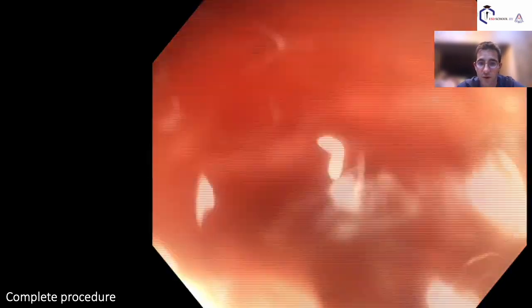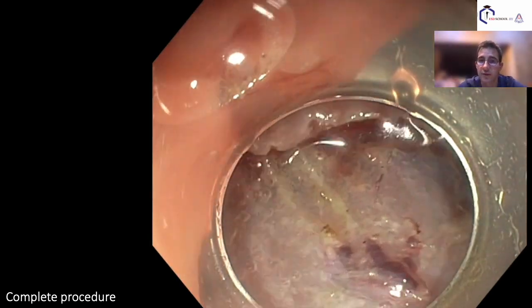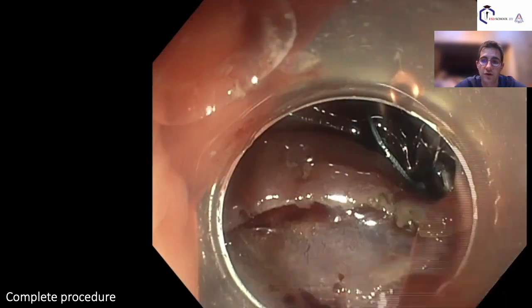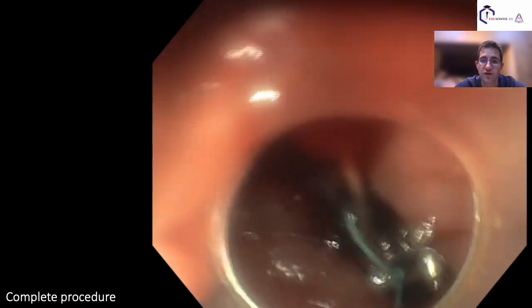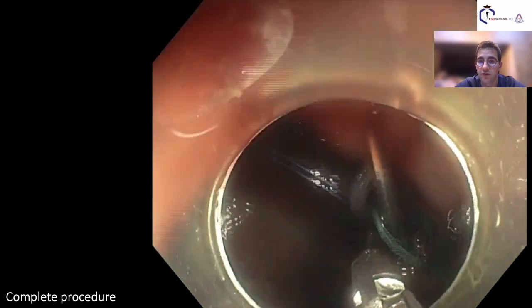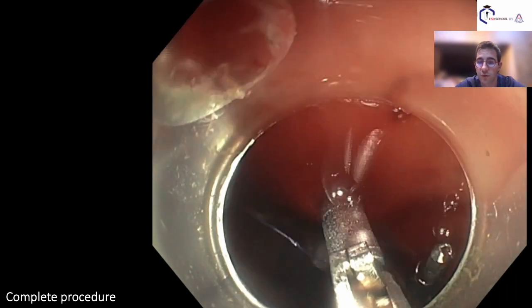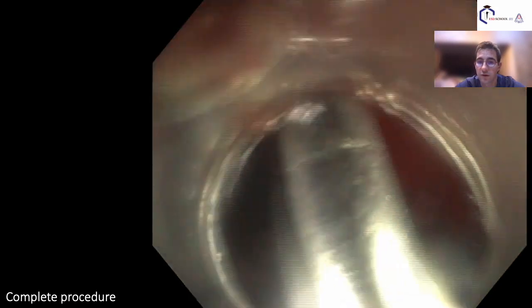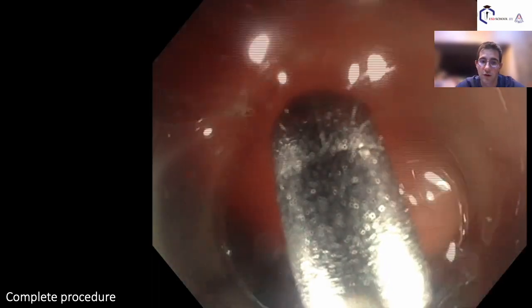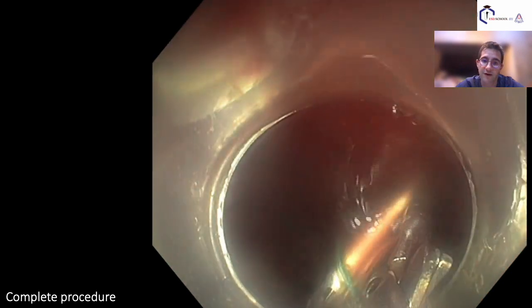And after we took the forceps to catch the clip which was fixed on the opposite wall of the colon, in order to remove the lesion and stretch it on cork to send it to pathology exam. So it is very easy to remove. There is no resistance. The clip has no real force when you fix it and stretch it, and when you pull back.